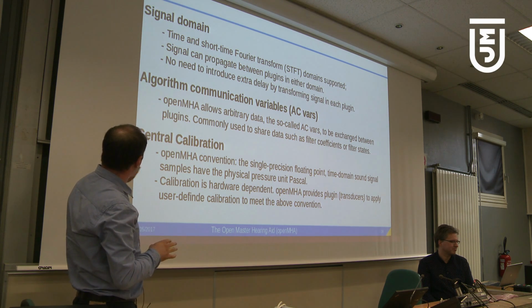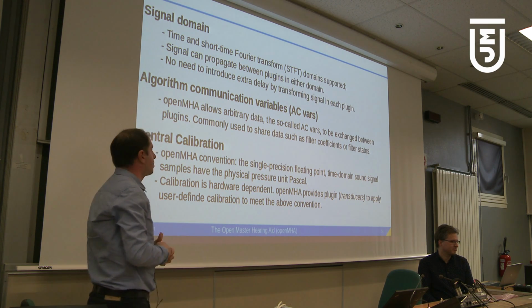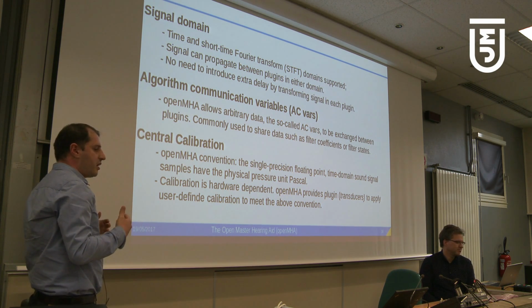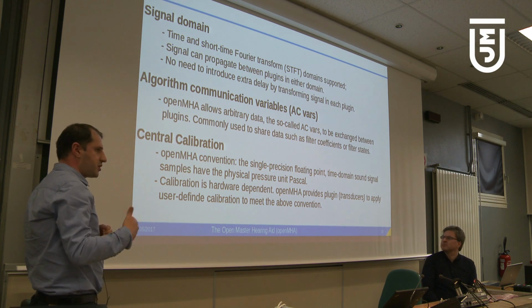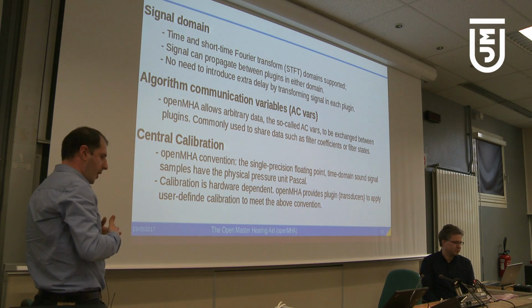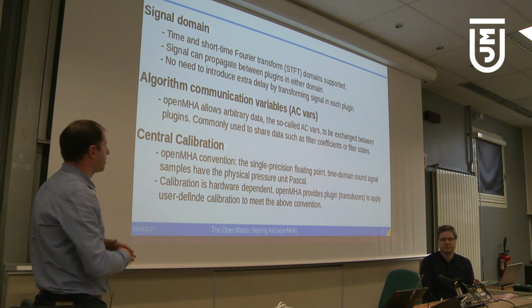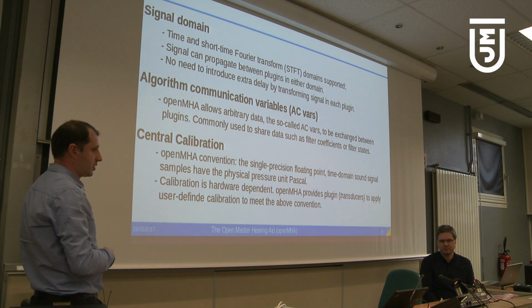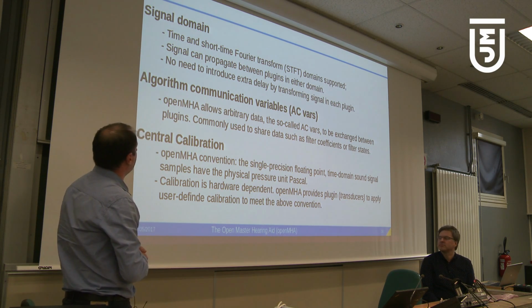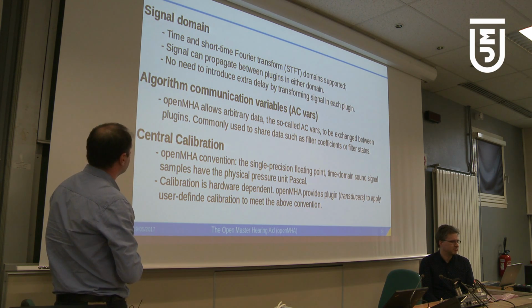In openMHA, both the time domain and the short time Fourier transform domain are supported, and plugins can do signal processing in either domain. So every time a signal is sent to a plugin, it doesn't have to do analysis and synthesis, which as we know will introduce extra delay. So this contributes in the direction of low delay that we want to have.